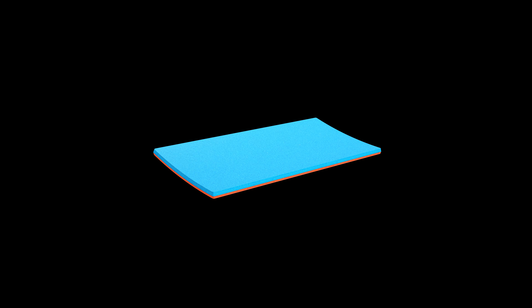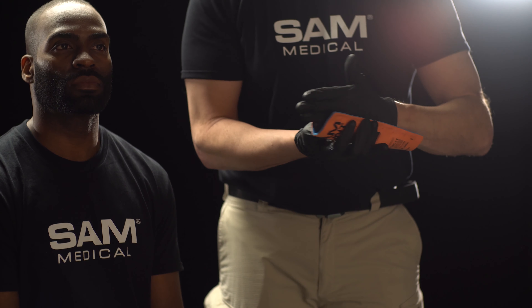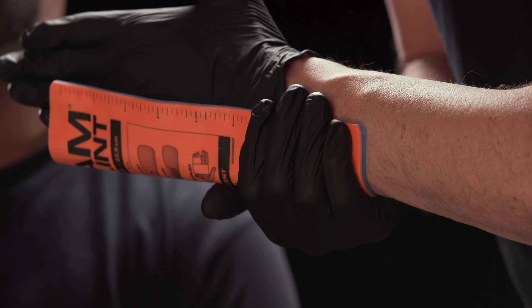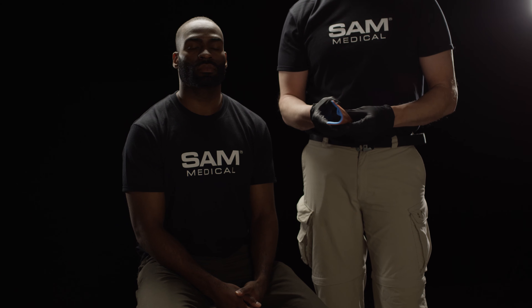Create a C-curve in which the wrist and forearm can rest. Using your arm as the template, mold Sam Splint to the ulnar or little finger side of your hand, wrist, and forearm to achieve the desired shape.